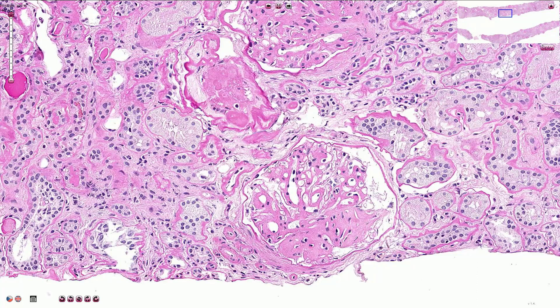Here we are looking at the slide of renal parenchyma with diabetic nephropathy. Here we are in the cortex of the renal parenchyma.